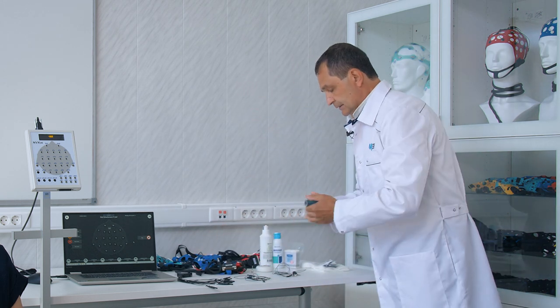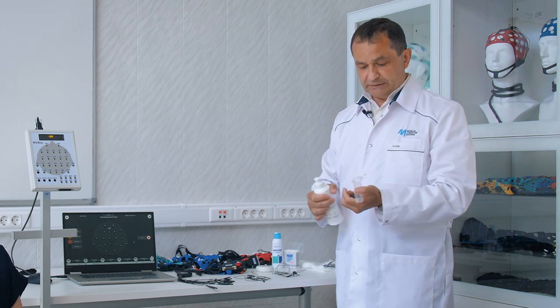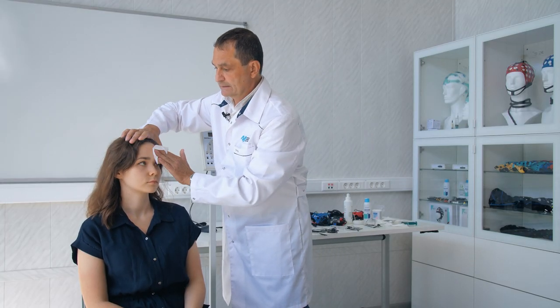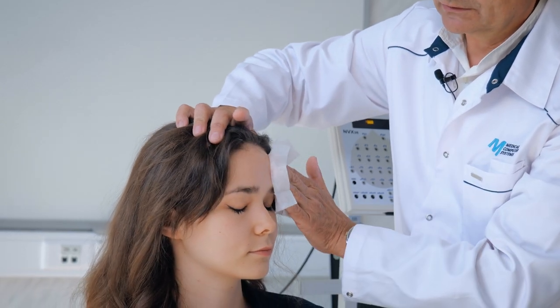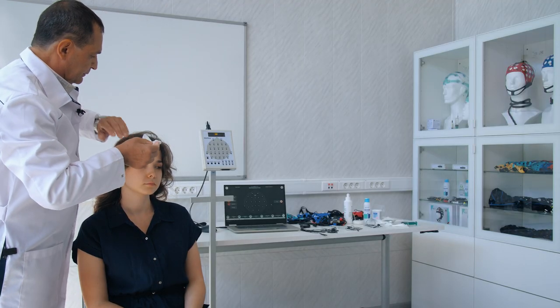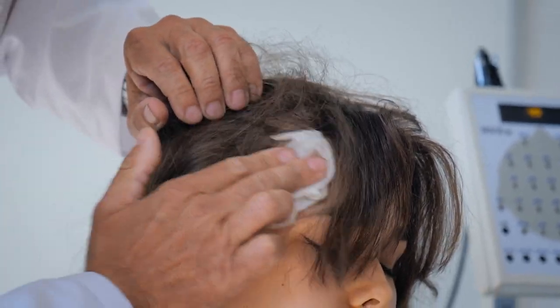Let's start the process now and proceed with caution. Fill the syringe with a thick-tipped needle, which has a larger diameter designed for injecting gel. Next, we begin the process of preparing the skin. It is crucial to ensure that the skin is thoroughly prepared in the areas where the grounding electrode and reference electrodes will be positioned. On the portion of the head where there is hair, we also carry out degreasing by applying alcohol in the intended areas to remove any grease or oil build-up.